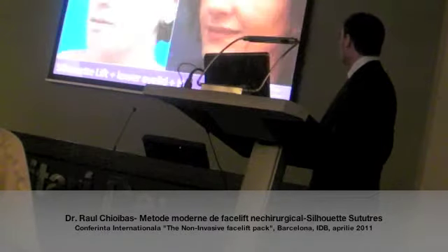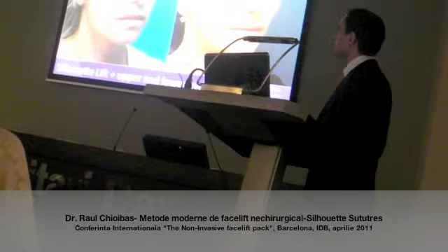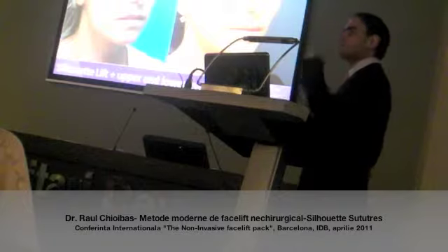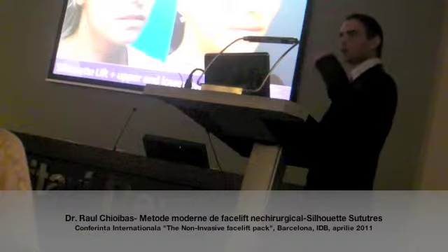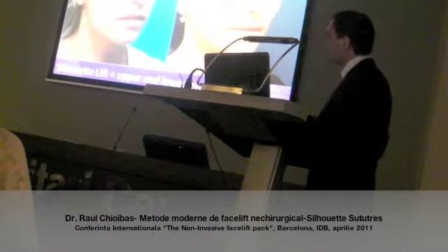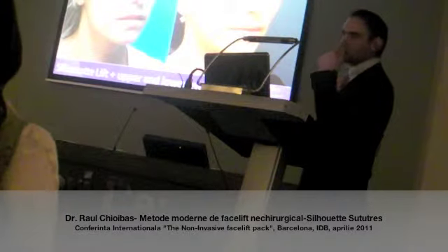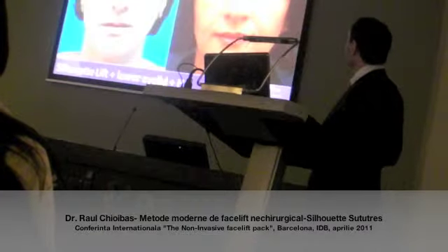You see before the operation, you see this herniated fat here. This was not excised. This was just repositioned in 3 points with little bourdonnets. So we went with a nylon suture and repositioned it in the area where we needed to make the fill, and tied the suture on a little bourdonnet, three pieces on each side. And this is the result after 1 month.